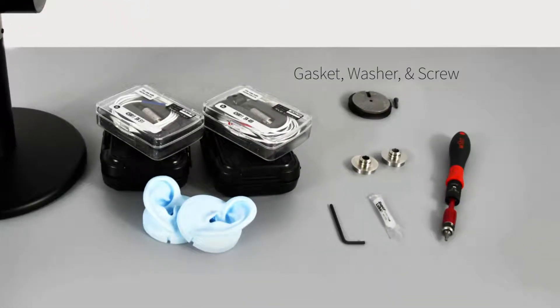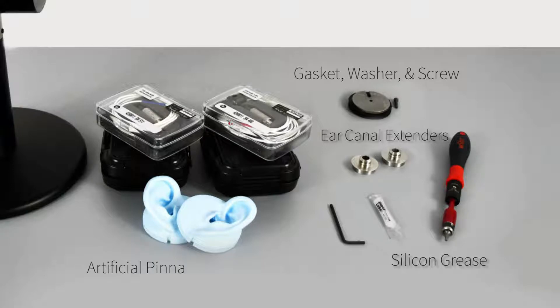You will need the gasket, washer, and screw, the two ear canal extenders, a tube of silicone grease, the artificial pinna, and the 2.5mm hex driver.